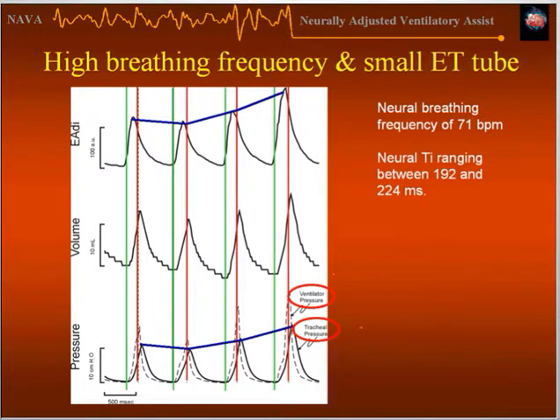There is a discrepancy between the ventilator pressure and tracheal pressure, as anticipated, due to the tube resistance. So there is a delay of the pressure that is delivered to the alveoli. However, the tube resistance can be overcome by this system, because if there is an increased load, you can increase your activation and you get more assist. So therefore, we have a high frequency response and we have a kind of ET tube compensation with this mode.